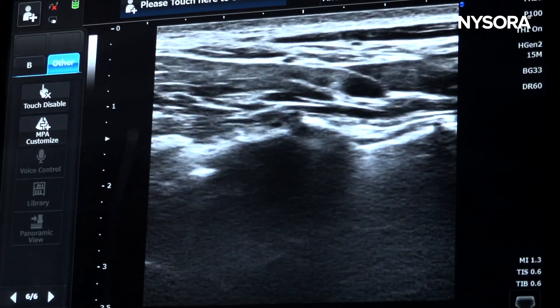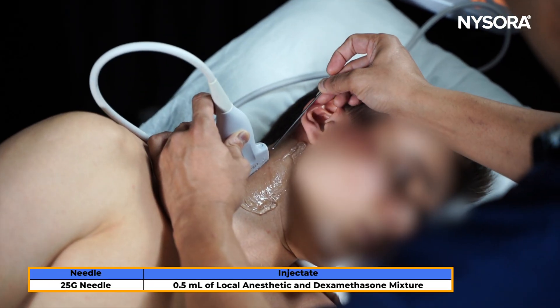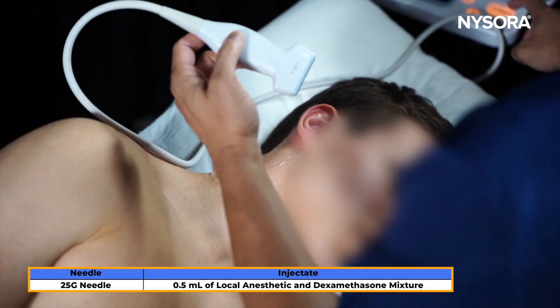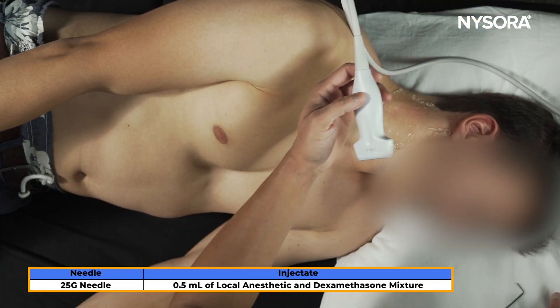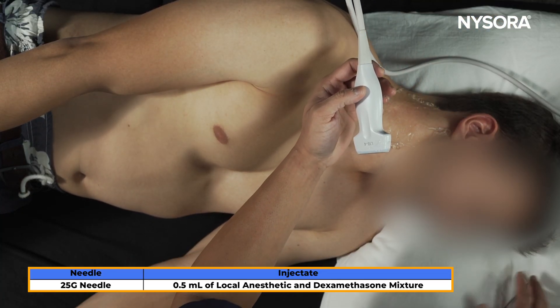The needle insertion would be out-of-plane or in-plane from superior to inferior. The local anesthetic and steroid mixture should be no more than 0.3 to 0.5 cc. Thank you.